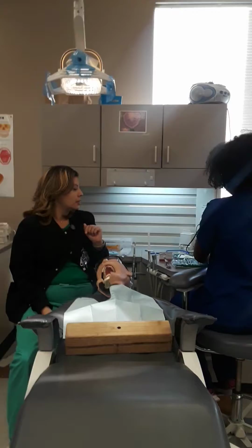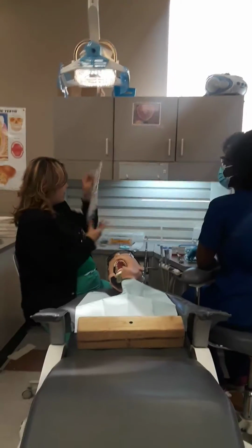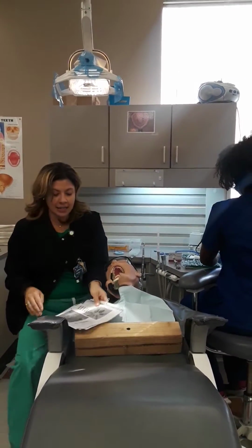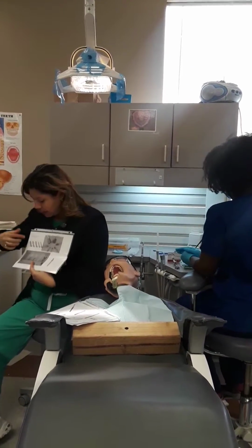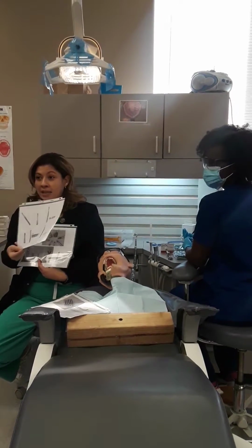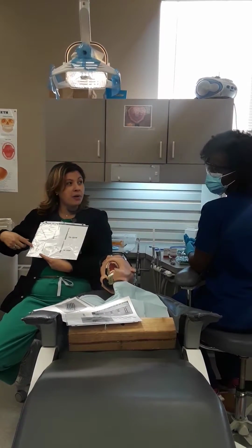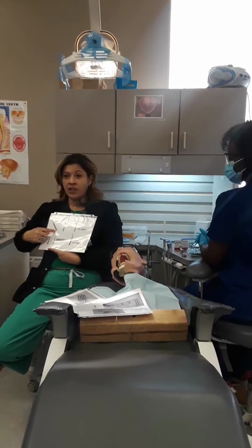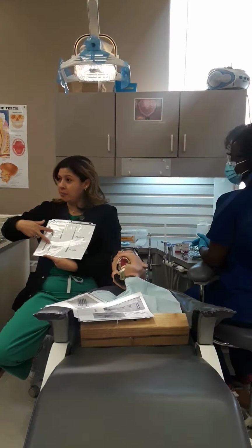Composite finishing burrs with paper and tape. Oh, finishing burrs. I got a grip of them. I know you can't see my little burrs, but they're here. This is my finishing paper. If you look, the flutes are what matter. This is my cutting high speed. For high speed here we have a 557 or 330 burr. High speed has an end that looks like this. It's friction grip. Each of these burrs accesses the tooth and starts the prep.